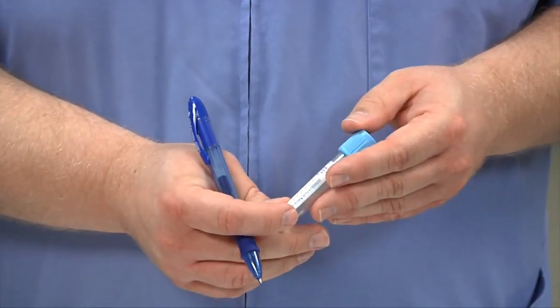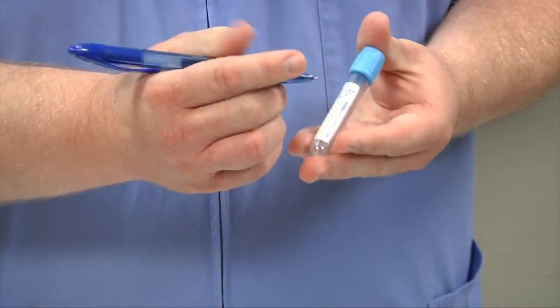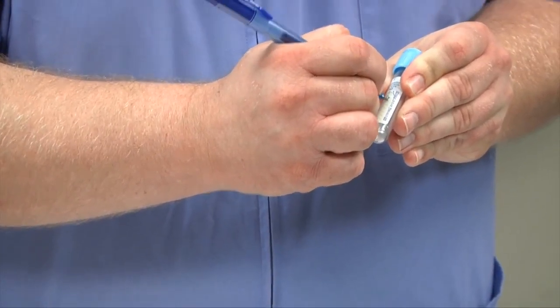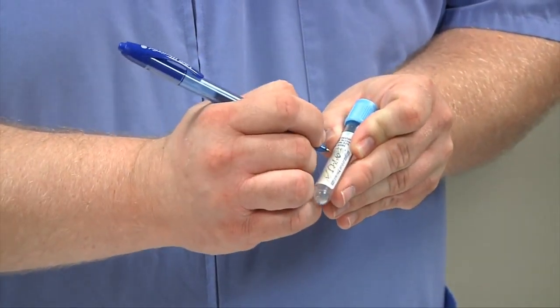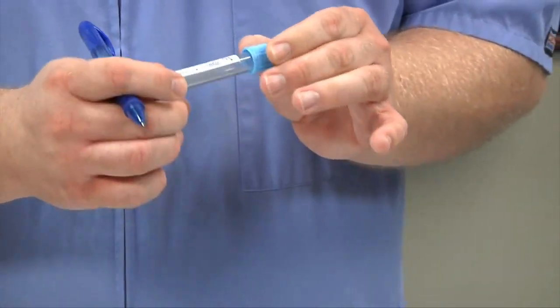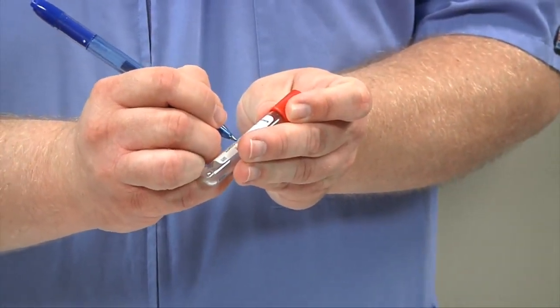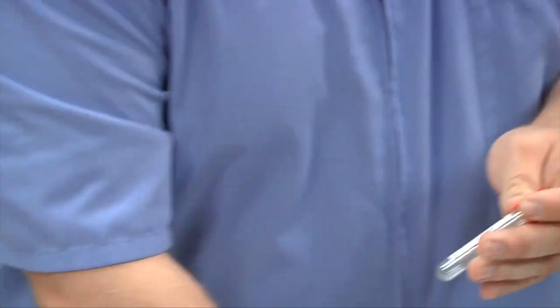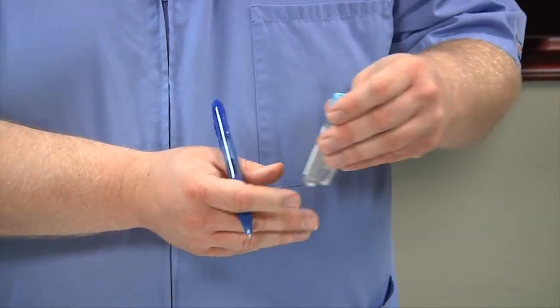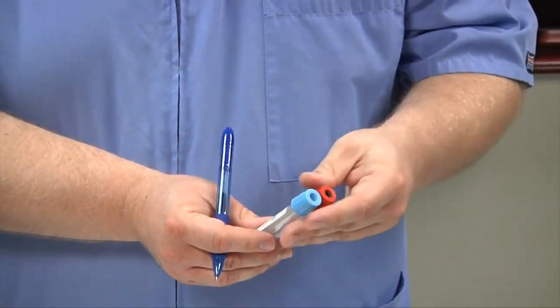That's the very last step of phlebotomy. After you've bandaged your patient, disposed of all equipment, and confirmed the patient is safe and not bleeding, you want to label your tubes with the patient's name — in this case, 'banana' — along with today's date and your initials. This goes on every tube you draw. Both tubes would then go in your lab specimen bag, and you would transport them to the laboratory either by the pneumatic tube system or by hand carrying.